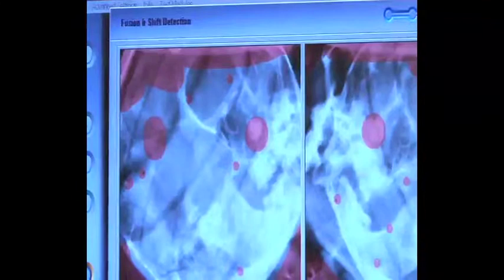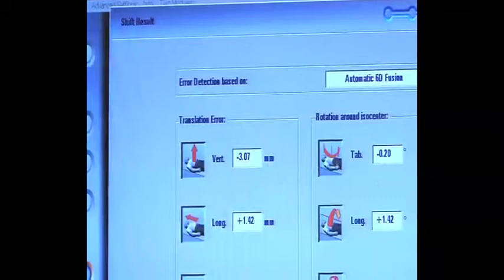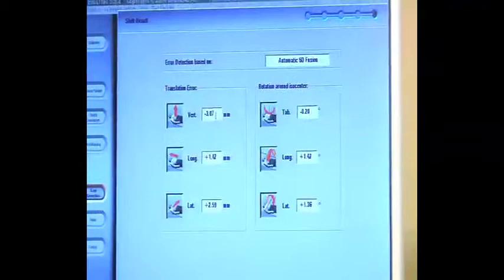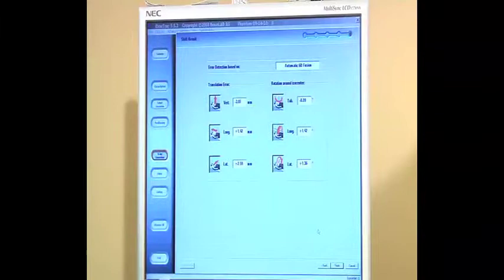I'll proceed by approving the fusion and go next to apply these shifts — the discrepancy between my current alignment and the patient positioning at simulation. Position my couch ready for cone beam CT acquisition.